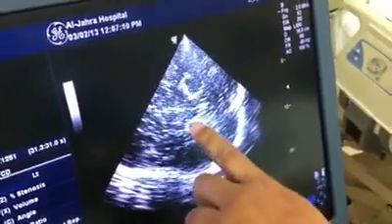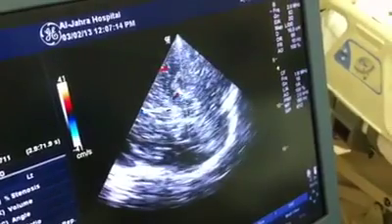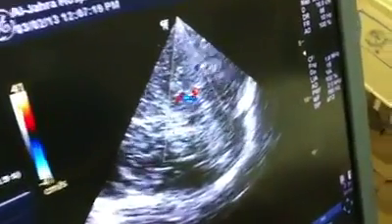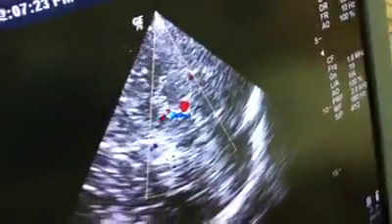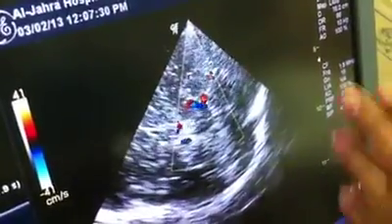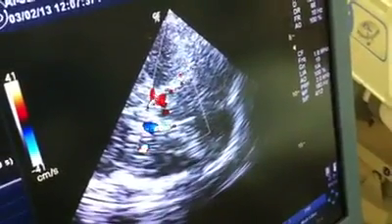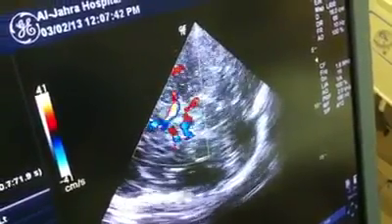This is the brainstem, and I'll put color over it. What I'm seeing are some pulsating color structures around the brainstem. All around it is the circle of Willis. I'm interested in seeing the left side of circulation. The two vertebral arteries become the basilar, then the posterior cerebral artery, and it goes there and becomes the anterior cerebral artery. And here what we are interested in is the middle cerebral artery.